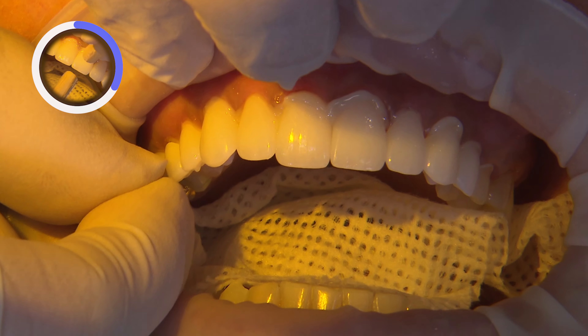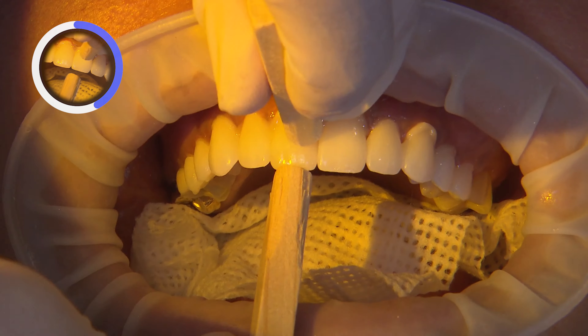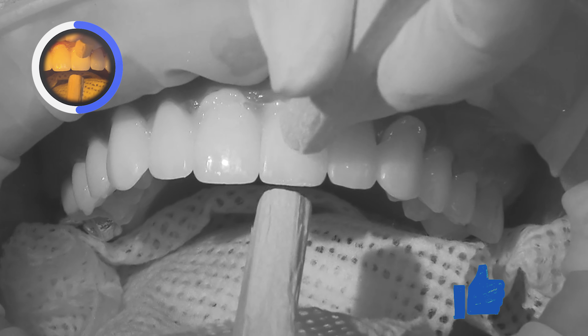Phosphate groups have a very high affinity for zirconia and can compromise bonding. Ivoclean is a special formulation that effectively removes these unwanted layers.